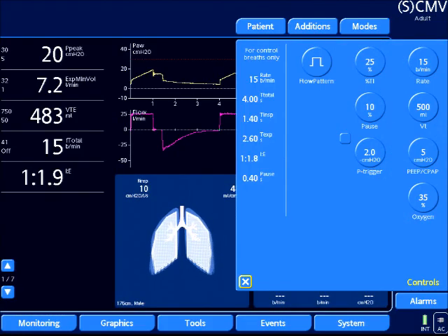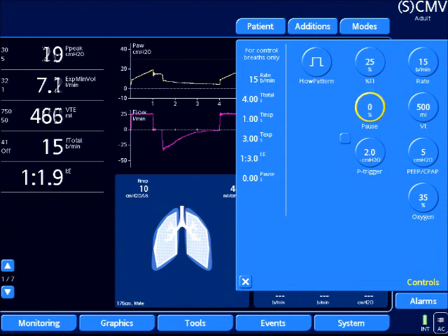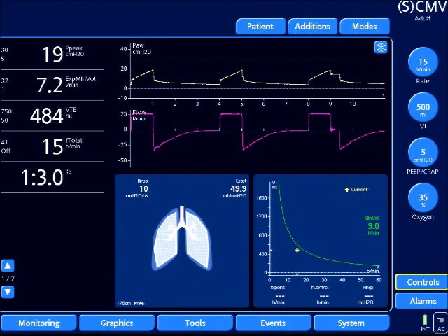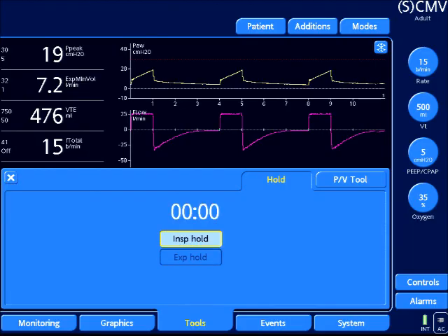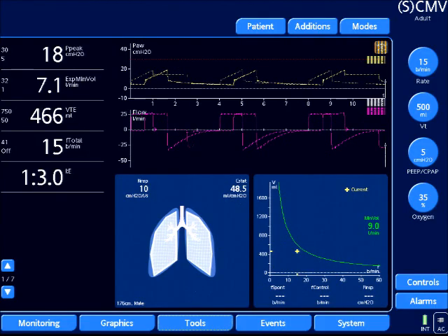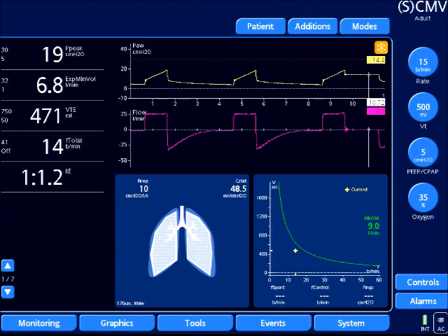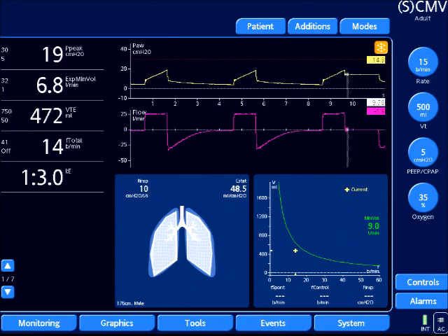However, setting a pause can be uncomfortable, so we'll just turn it off. Another way is to use the tools that a lot of newer ventilators have. I'm going to select my tools tab and do an inspiratory hold for a few seconds to create the plateau. Then I'm going to use the control knob to scroll back over and view my measured value. You can see my plateau is approximately 14 and my peak is 18. That's how I do it with volume control ventilation.